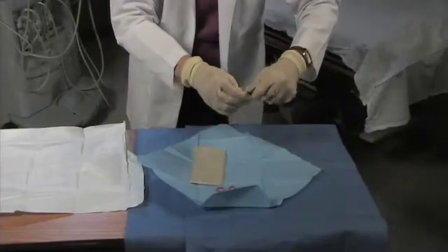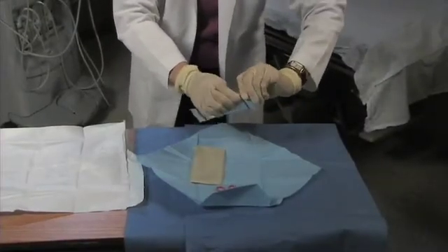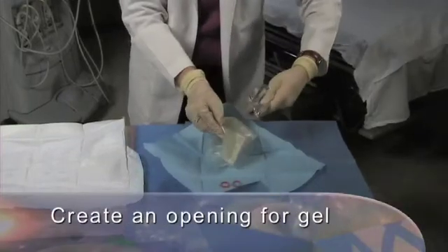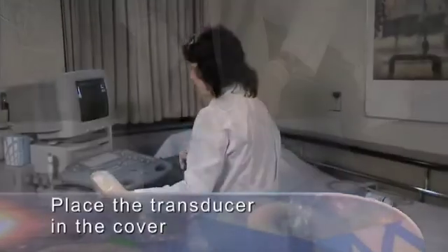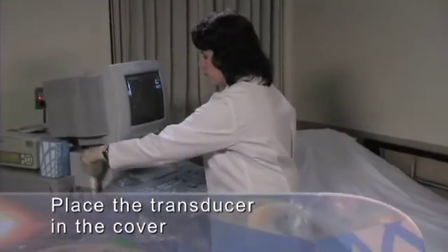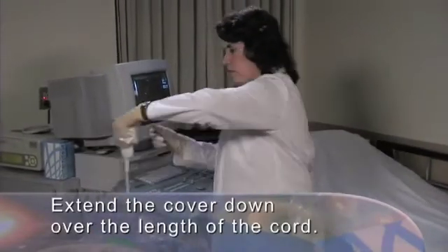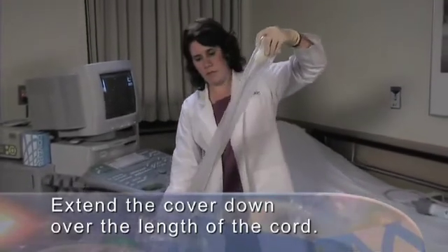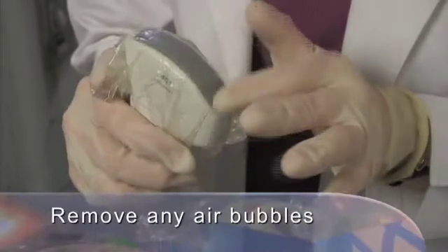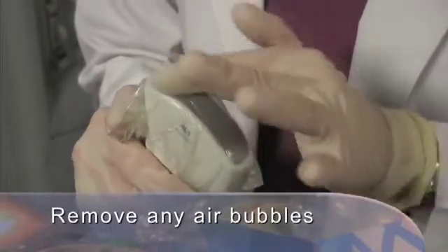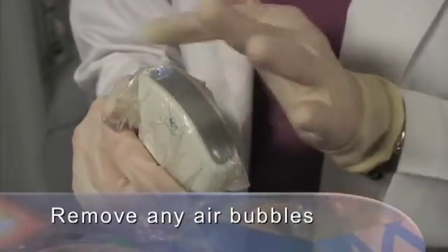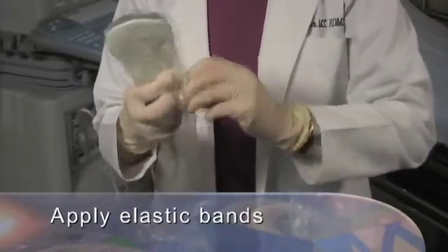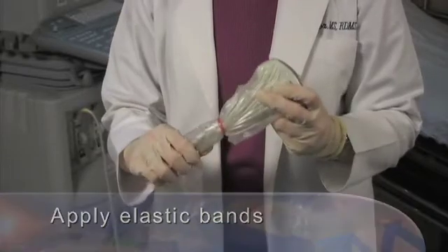Using the single person approach to applying a general purpose transducer cover, open the sterile gel packet, then create an opening in the cover and apply gel. Once the gel is in the cover, place over the array of the transducer and extend the cover down over the length of the cord, ensuring proper sterile technique. Check carefully and remove any air bubbles that are between the transducer face and the cover. While remaining in the sterile field, apply enclosed sterile elastic bands to secure the cover in place.